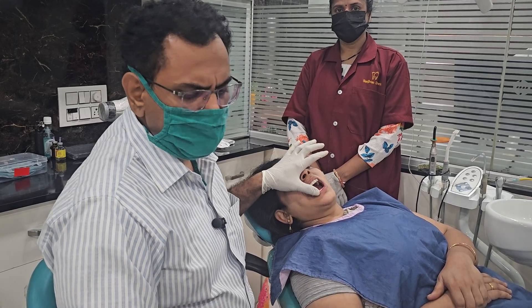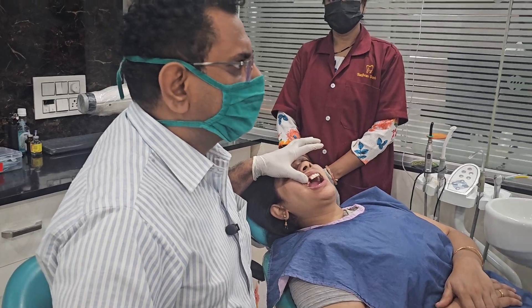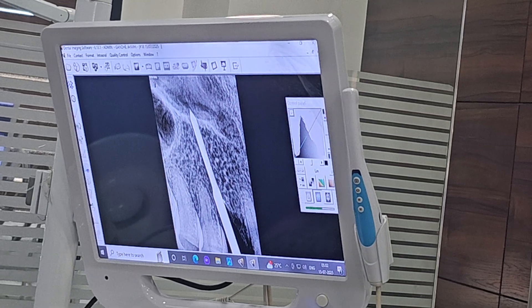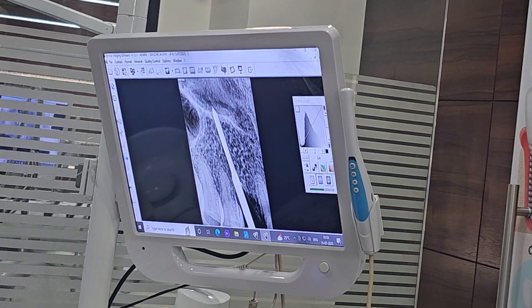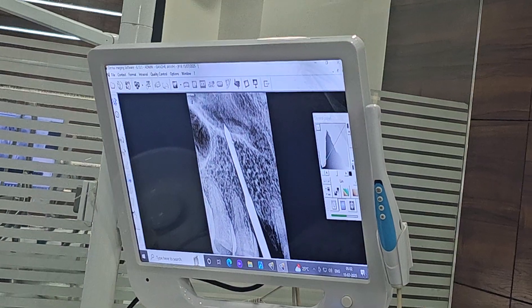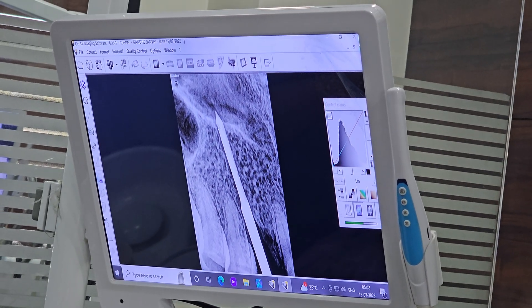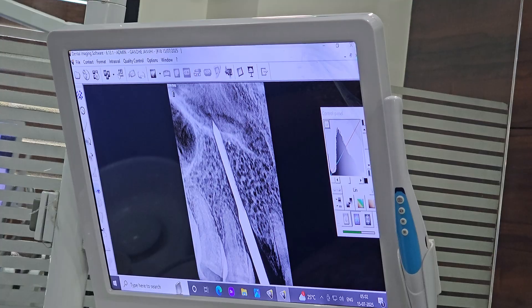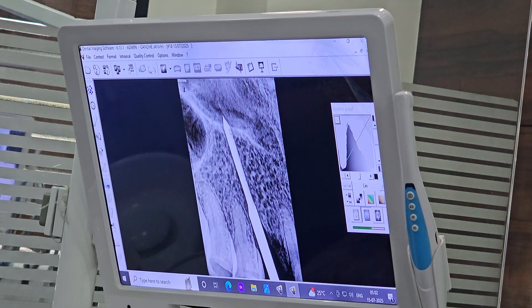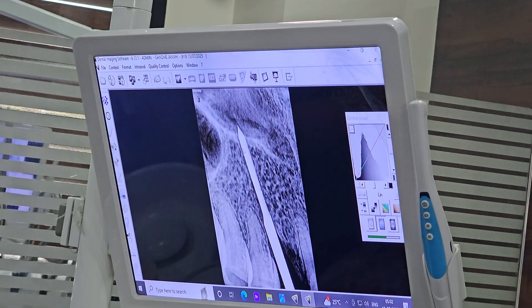I have also done the osteotomy for this site and taken an x-ray. This is the lance drill that I used, and you can see it has perforated the second cortical in the maxillary buttress area. This is very strong bone — you can see there is lots of calcification here, and there was lots of resistance to drilling over this area. We got a very beautiful osteotomy.